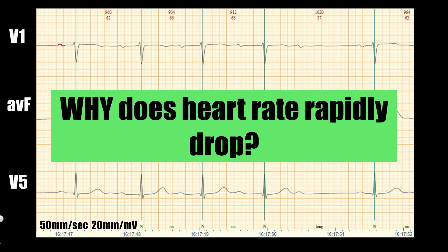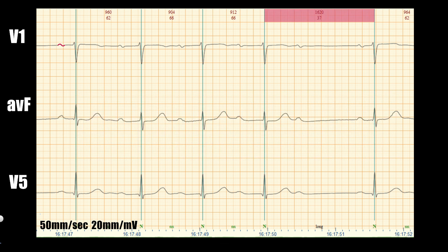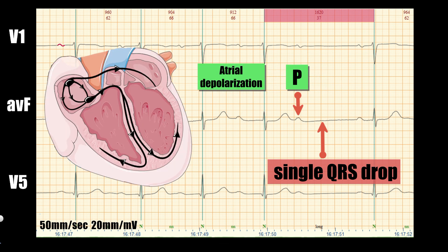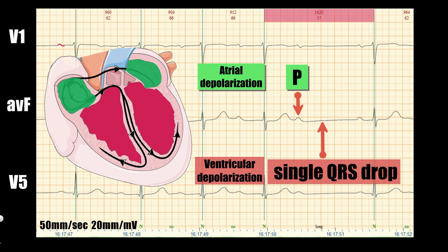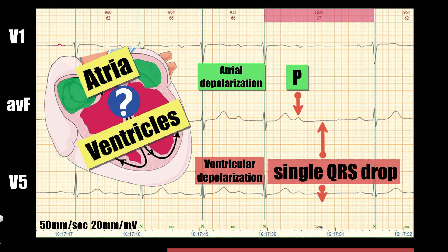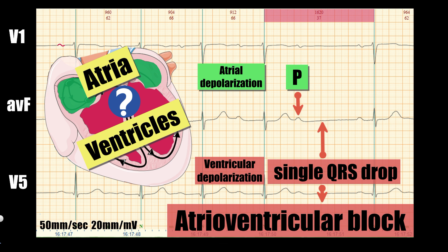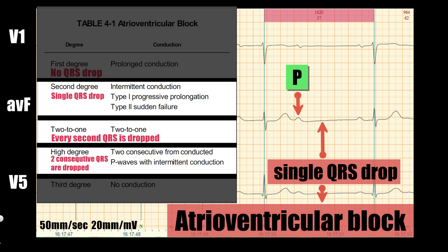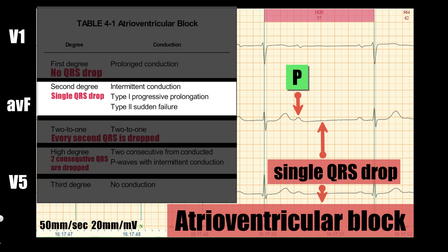Now let's find out why we have that rapid heart rate drop. Inside the long RR interval, we see one sinus P wave which is not followed by a QRS complex — this is a single QRS drop. The P wave as atrial depolarization is present, but QRS as ventricular depolarization is absent. So something is wrong with the conduction between the atria and ventricles, indicating some kind of atrioventricular block. A QRS drop means at least 2nd degree AV block, and with only one QRS drop, this is no higher than 2nd degree AV block.